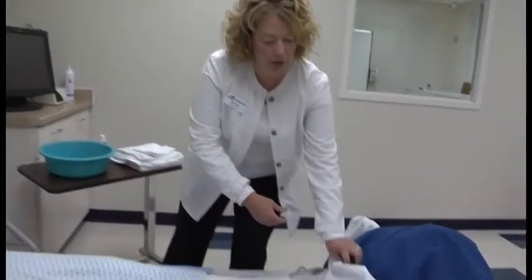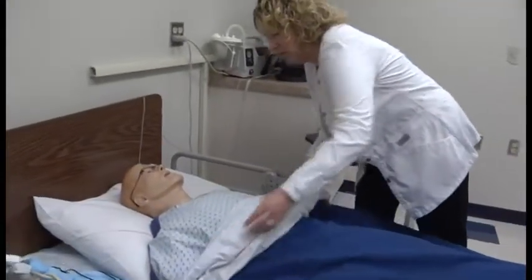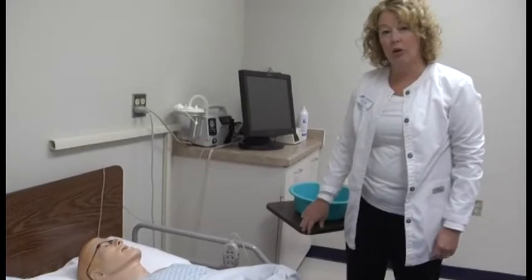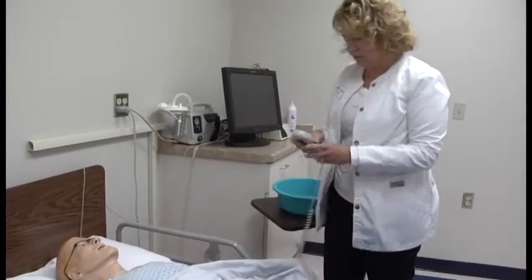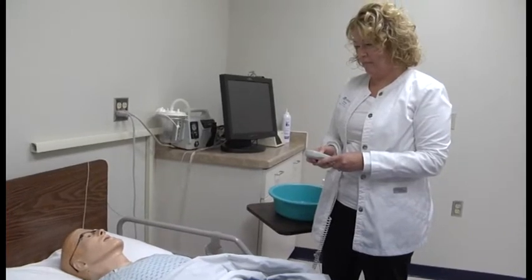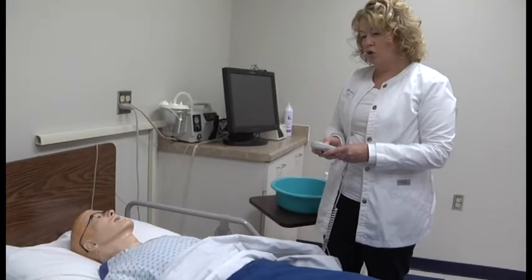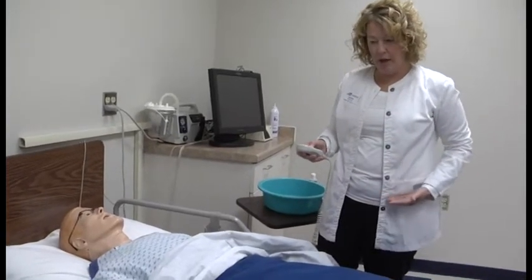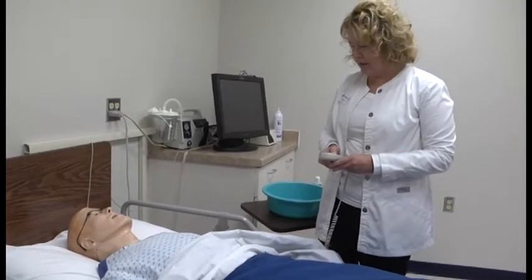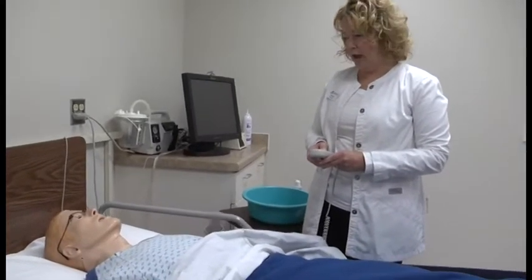So I would be starting with the face and the neck. So actually at this point, I wouldn't have my patient uncovered at all. I'm going to raise the bed to a working level. Usually working level should be about hip height. Unfortunately, this bed doesn't go quite that tall, but we'll work with what we've got.